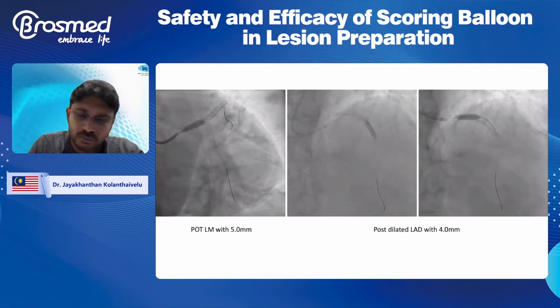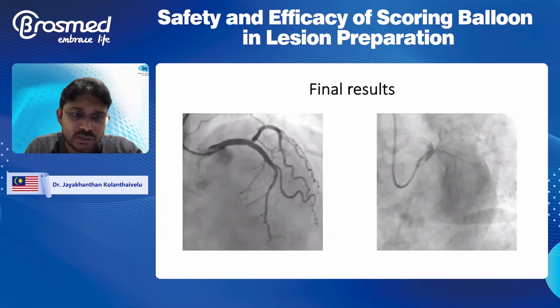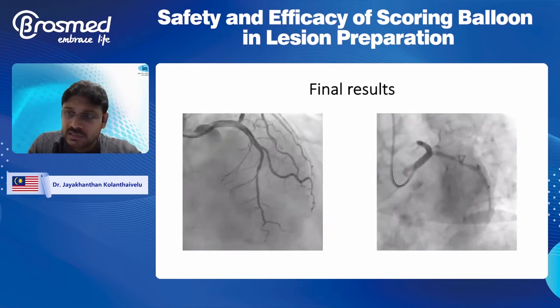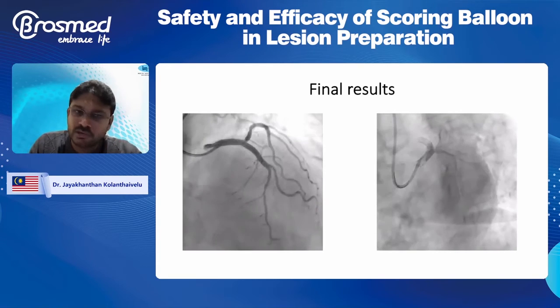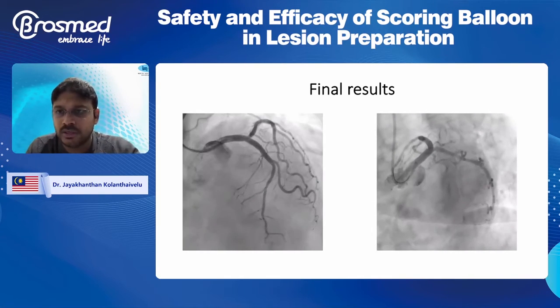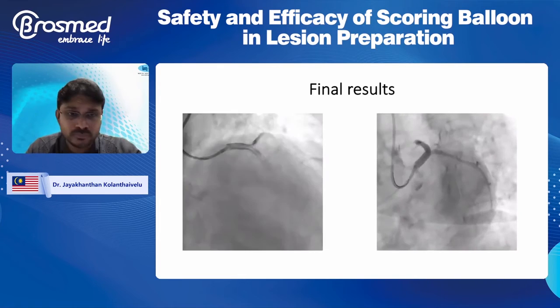We post-dilated the left main with a 5.0 at high pressures, 22, 24 atmospheres, and the LAD with a 4.0 NC, and we achieved very good results, and we were quite happy with this. In this case, there was a little bit of calcification. We managed to overcome that with scoring and very controlled dissection. We were not too worried about the circumflex. We knew that the ostium was good. We're not going to run into any trouble. IVUS also showed very good MSA.